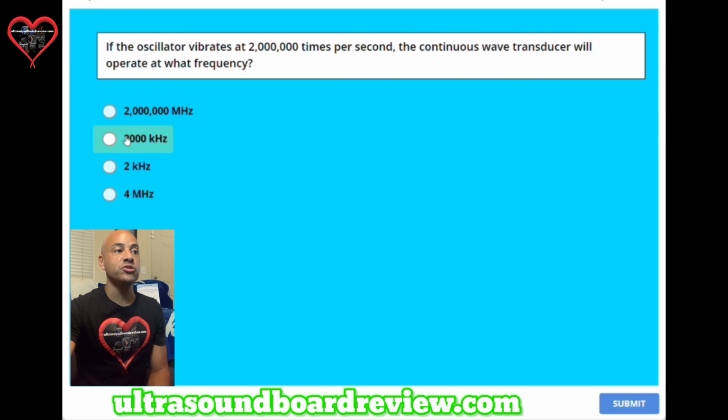The answer is B, 2000 kilohertz. The amount of times that the oscillator vibrates per second is equal to the operating frequency of a continuous wave transducer. Also, just like I said before, make sure that you're able to convert from one unit to the other, so you're not confused on your boards.